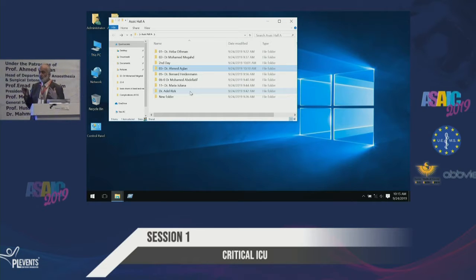But pressure control, pressure support is a good one to handle for the pressure, for the time. And the flow and the volume will be determined by two: driving pressure of the machine and driving pressure of the patient. And you can see what the problem is for your patient. I can gradually decrease the driving pressure of the machine, but the patient is taking his breath, normal volume, normal respiratory rate. This is a wonderful patient. But if you are stuck to the volume, I think this is exhausting the patient, and finally you will not be able to wean the patient from the machine. That's my advice, to be away from volume.